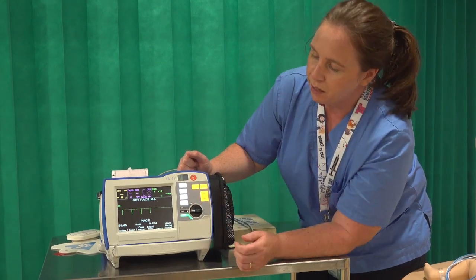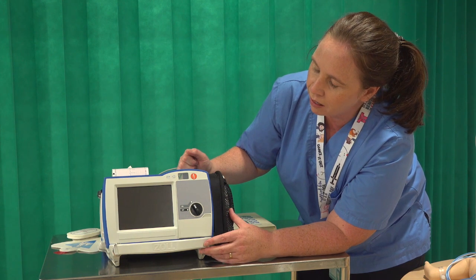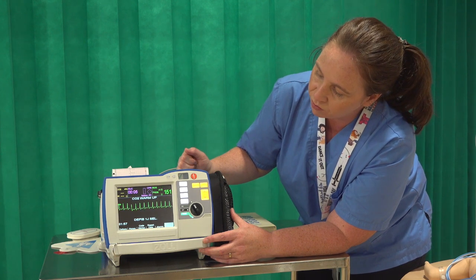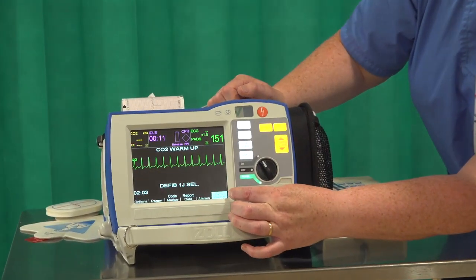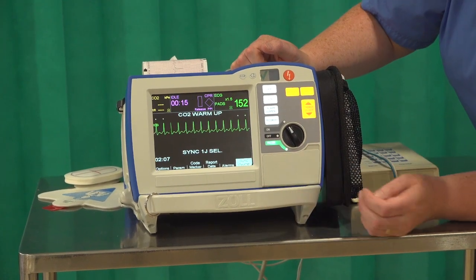From a neonatal perspective, the key button to be aware of is synchronised cardioversion, as that's the one you'll probably be using most frequently. For synchronised cardioversion, the key thing you need to do is make sure your sync button is on. Down in the right hand corner it shows sync on and off — hit that soft key underneath it to action it.